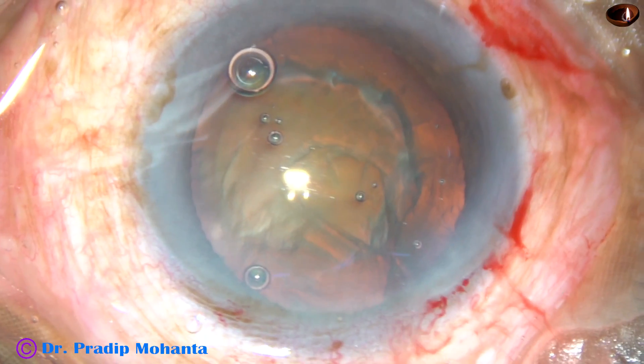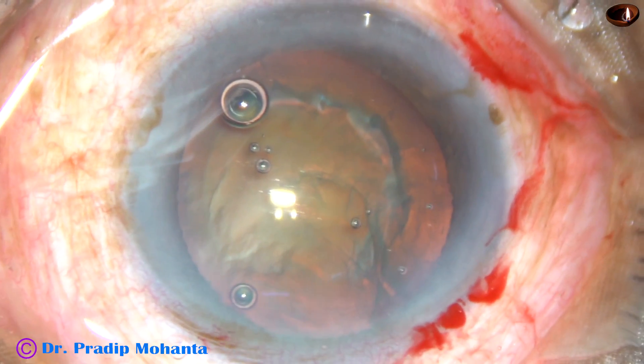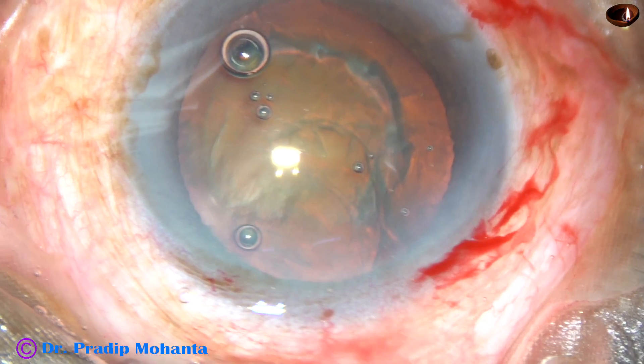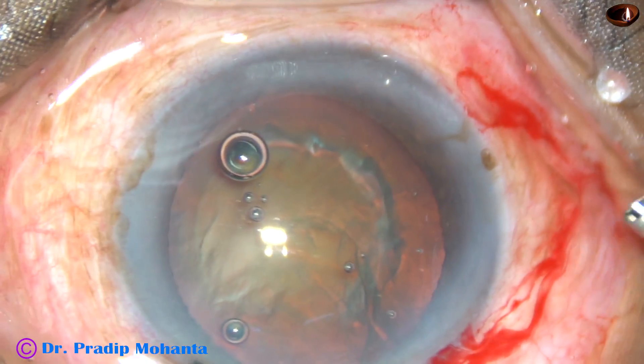Now viscoelastic is injected again and now is the time to introduce the tip of the phaco handpiece. This is the Oertli Cataracts 3 phaco machine.